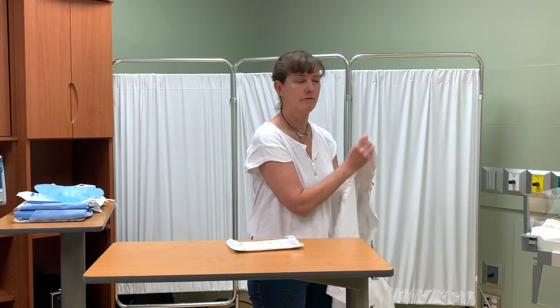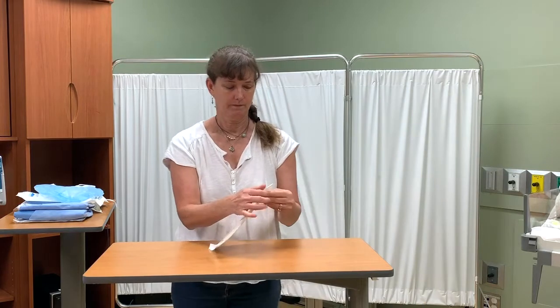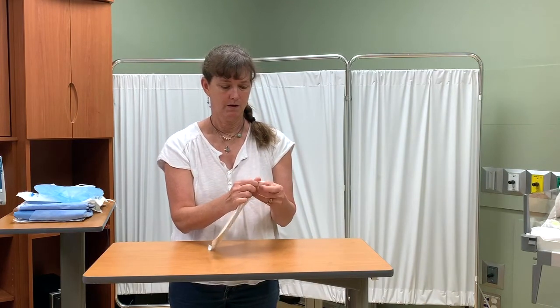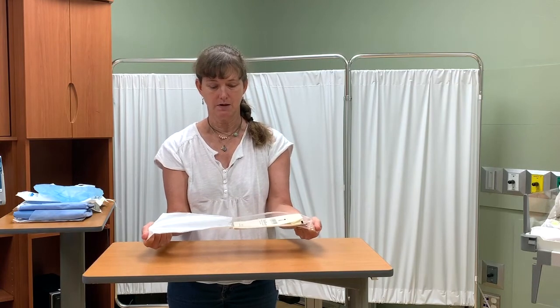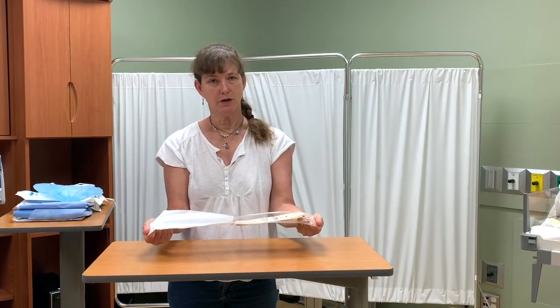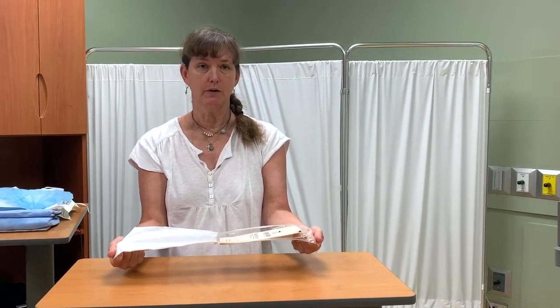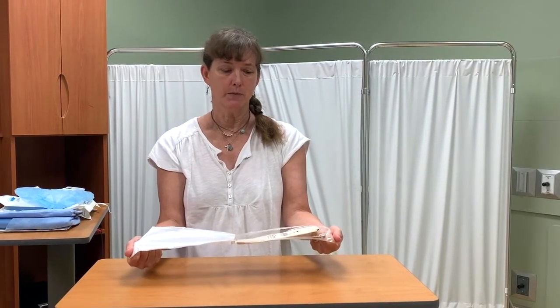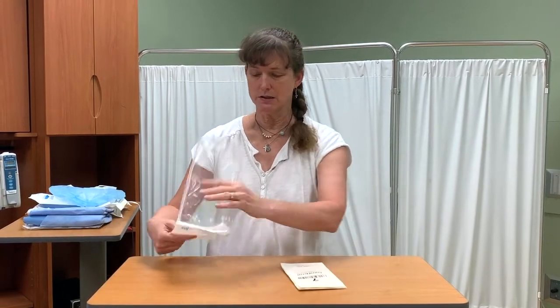If I was going to put on a catheter, I would get rid of my lab coat. It's nice to open my gloves on a flat surface. Most of the time when we do our Foley catheter, the patient is actually in the bed after an epidural and we set our tray right there. But if you have trouble maintaining sterility, go ahead and glove at a table side next to it. Okay, so I don't need this anymore.